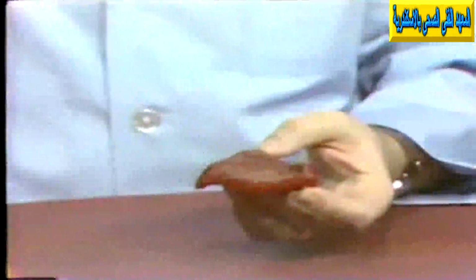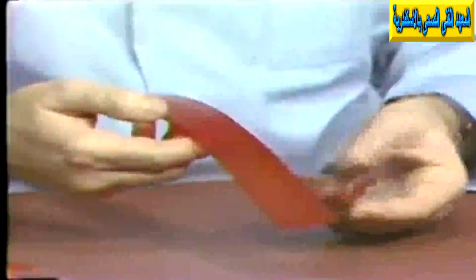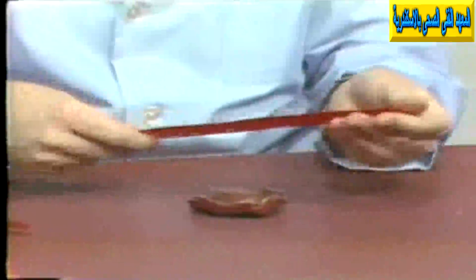The next step in this procedure, and this can be done very quickly after experience of a couple of times, a maxillary impression can be boxed within a couple of minutes. The next step, and the final step really, is to take a boxing strip, the flat wax strips, which we'll also supply for those who desire to make the master cast in this manner. And this should also be softened and flamed so it has complete workability. In this case, under these lights, there's no problem, and I suppose there would be no problem in the laboratory. But if the wax is stiff, it simply should be heated.